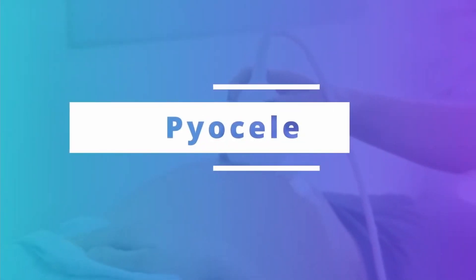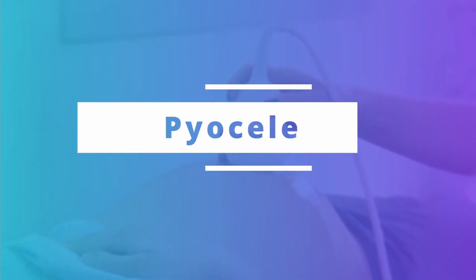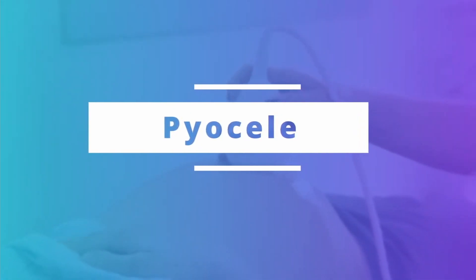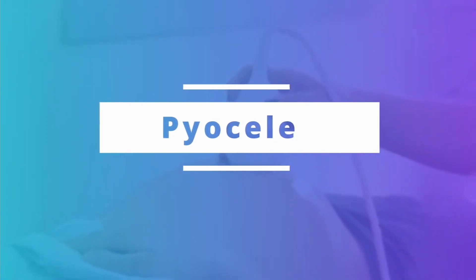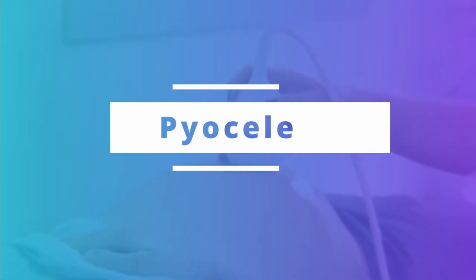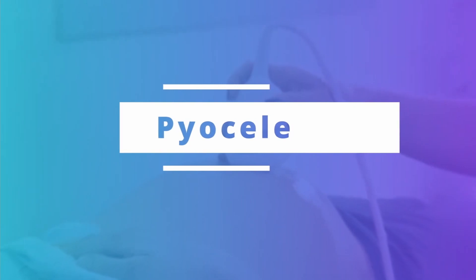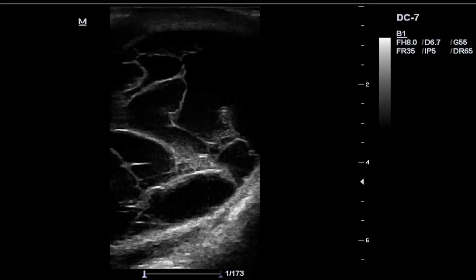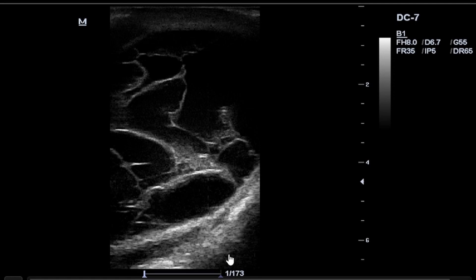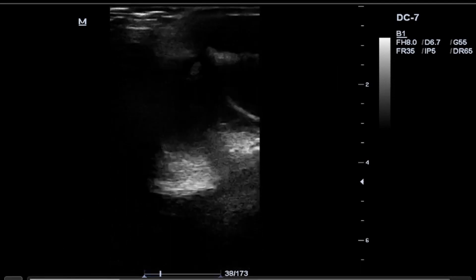In this tutorial I am going to discuss what is called a pyocele. In this case presentation I am going to discuss a typical case study of a scrotal pyocele — specifically a hemiscrotal pyocele. A pyocele is actually a purulent collection of fluid surrounding the testicle in the potential space of the tunica vaginalis, and it can be distinguished from a hydrocele by the presence of internal echoes consistent with debris, septations, or loculations.